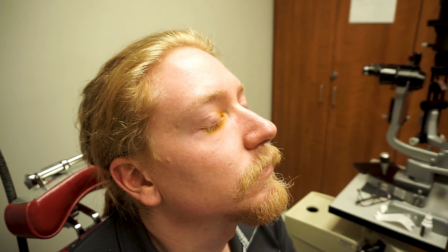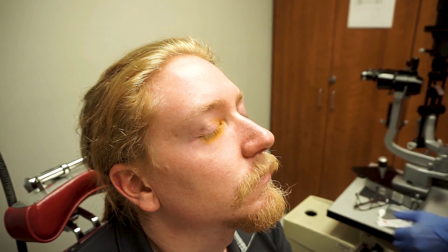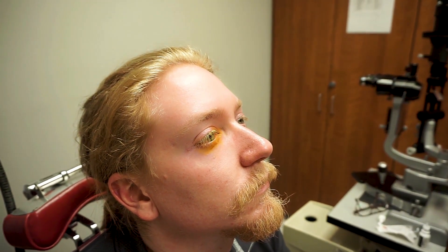Retract the lower eyelid with your finger and touch the fluorescein strip gently against the palpebral conjunctiva. Do not touch the fluorescein strip directly on the cornea or conjunctiva as this will cause a corneal or conjunctival abrasion.